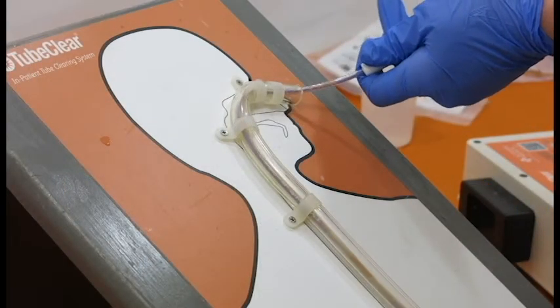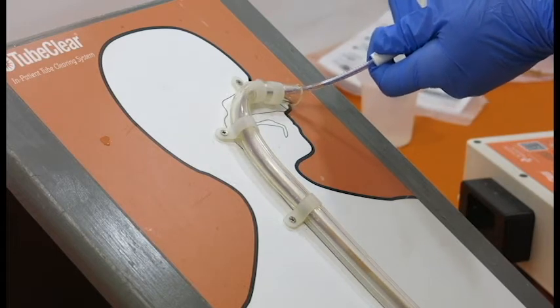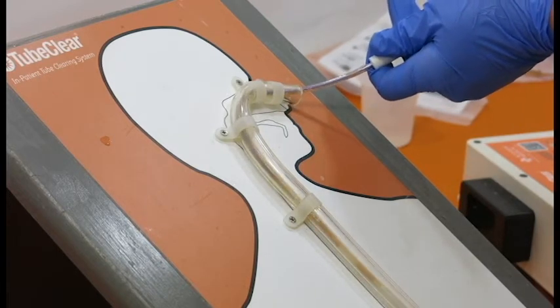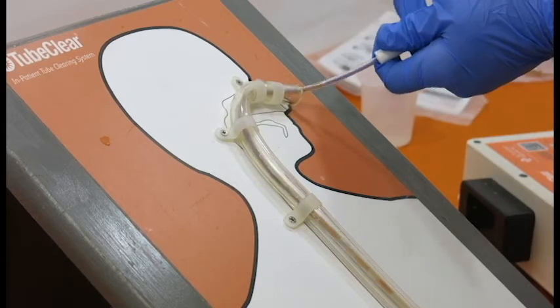Periodically, pull back on the clearing stem to help spread the material. Be sure to maintain the long, smooth motion.